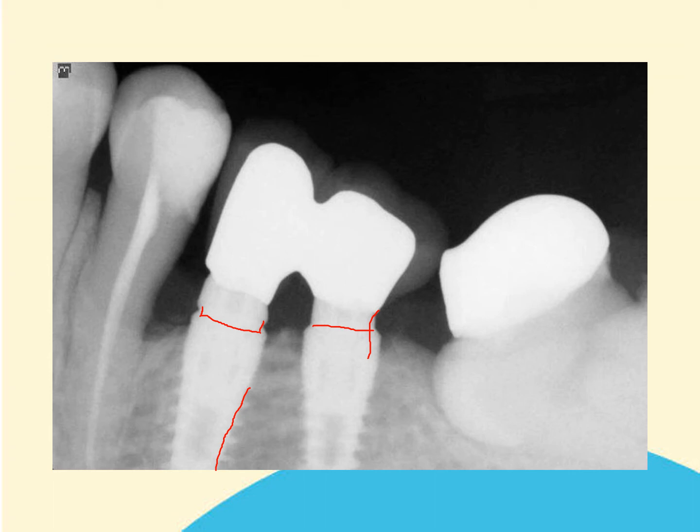Obviously, much of this depends on the angle at which the tube is positioned, and sometimes this can make an anchor lock look like a series 2 because of angulation and superimposition of the two images of the abutment against the implant body. However, this would be quite obviously a series 2 type of connection, being as there is no space between the two.